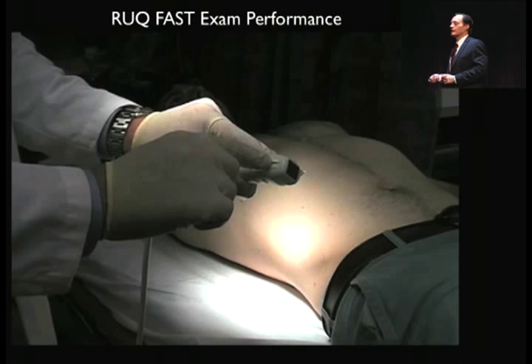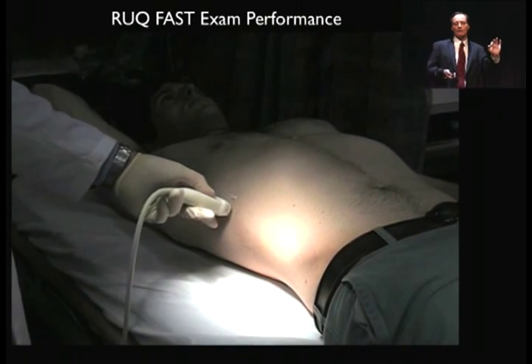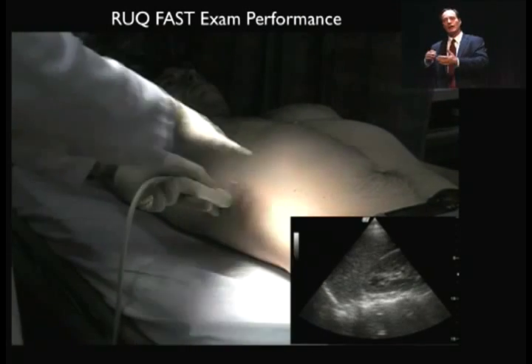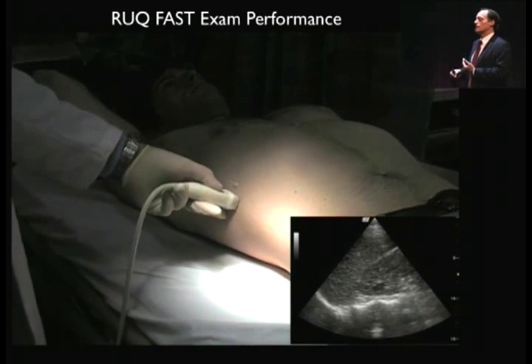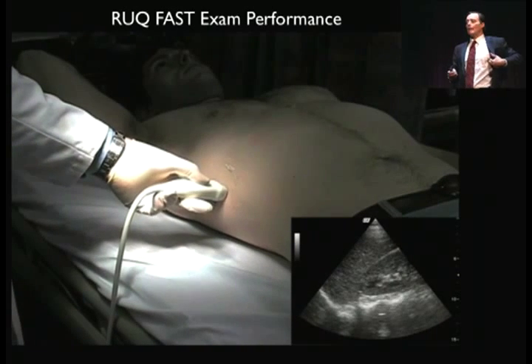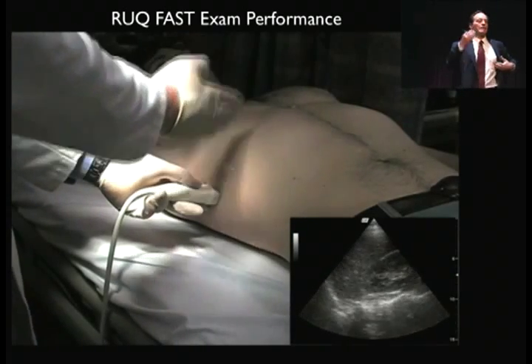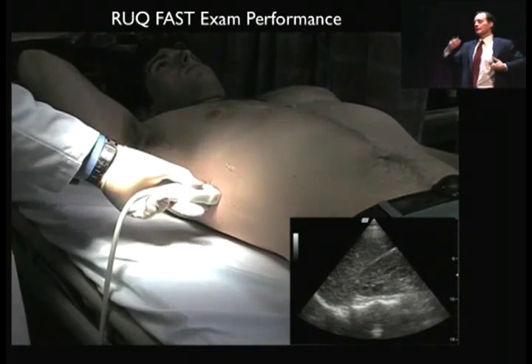Okay, here's how to perform the examination. You're going to want to have about a 3 megahertz, a lower frequency probe. You're going to place it in a long axis with the probe marker towards the patient's head. As you can see here, we have it placed right onto the right upper quadrant. I'm up pretty high right here. You can see the probe is at a level about underneath the diaphragm. I'm just showing that that's about the level of the diaphragm.